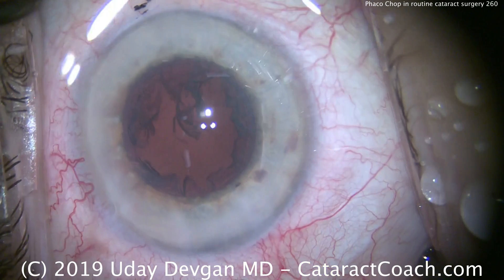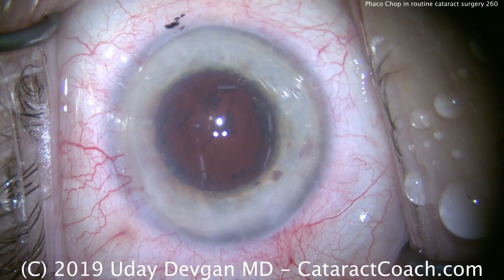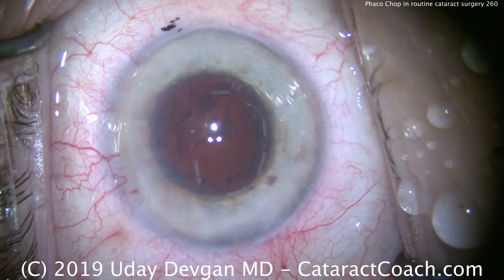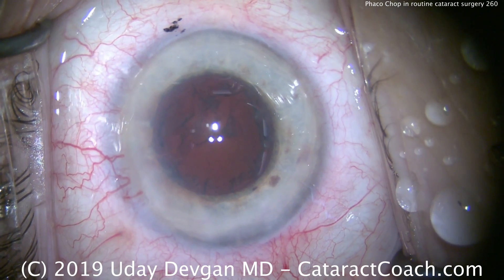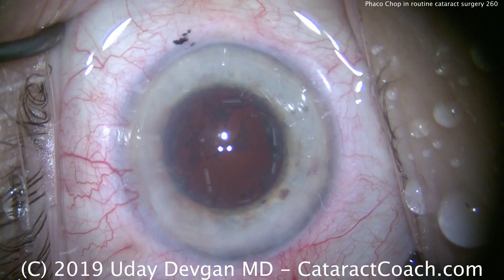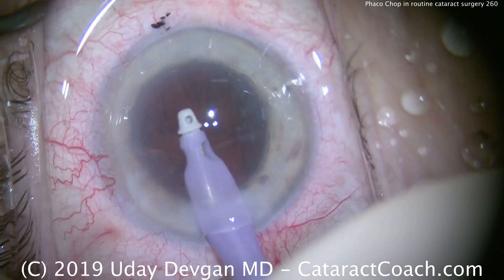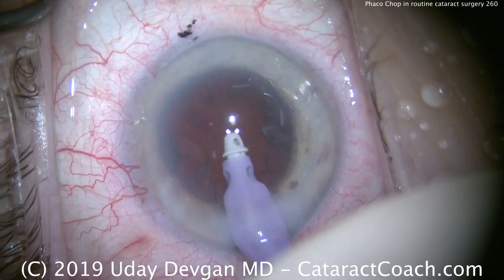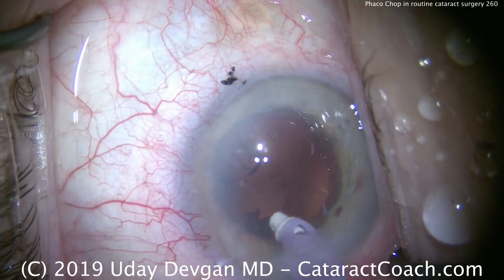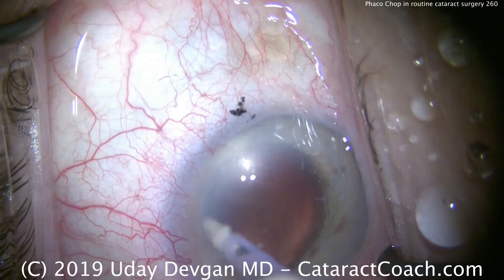Clean that up — it looks beautiful. Now time for irrigation-aspiration cortex removal. We want to make sure we completely empty the capsular bag, but we also want to confirm this patient doesn't have any zonular issues. That means look at the capsular rhexis edge as you're doing the cortex removal — that rhexis edge should be absolutely stable and still, it should not move. We'll flip around in various directions and get all this cortex out. This is looking pretty clean.